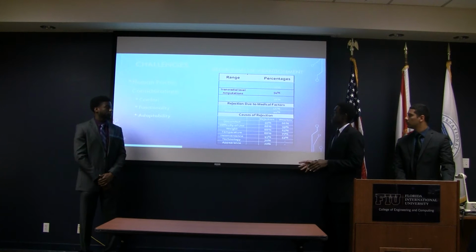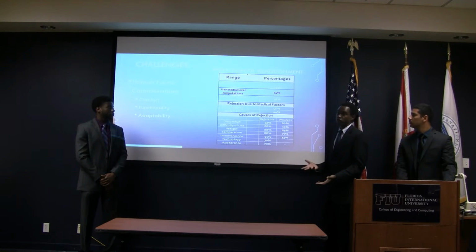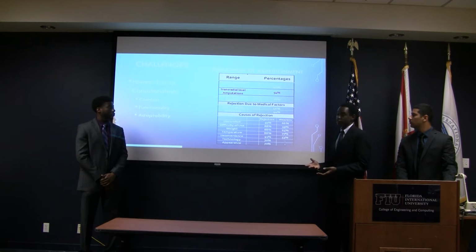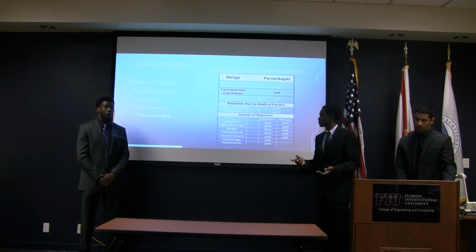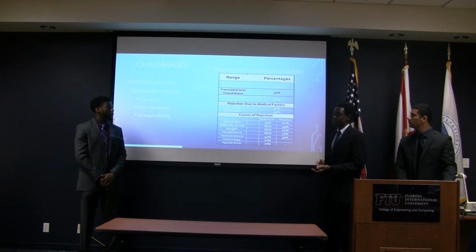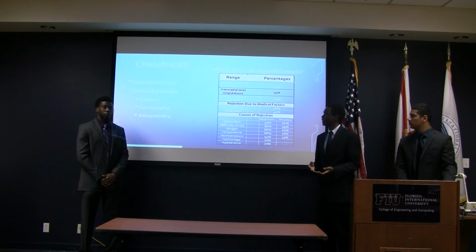Our main focus is on transradial level amputations because the majority of amputations are transradial level, at 54% overall in the general body of amputees. Causes of rejection include skin irritation, body pain, discomfort, weight, technology, and appearance. As you can see, among both rejectors and wearers, the percentages are pretty high. So even for wearers, they find that sometimes prosthetics just don't enable them enough to actually bear it throughout the whole day.